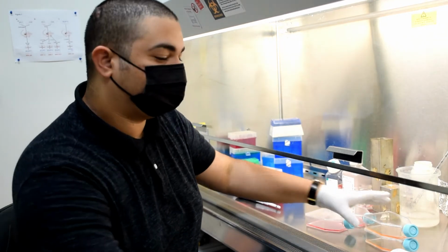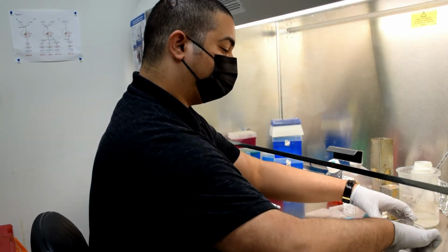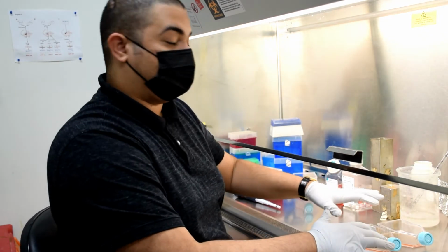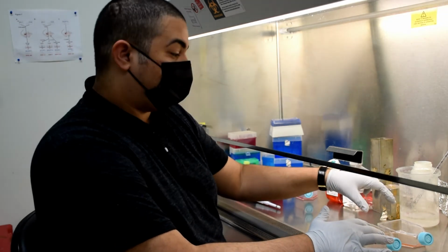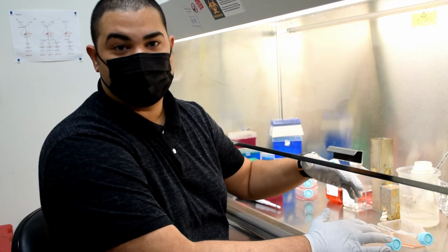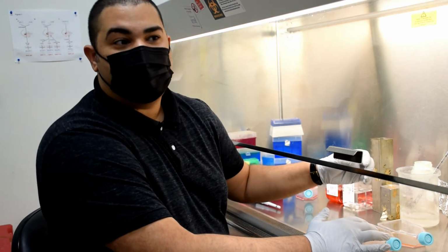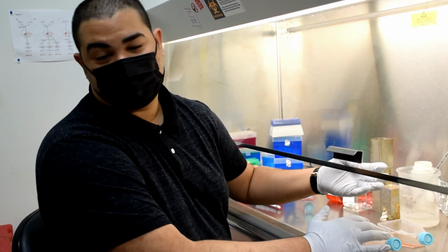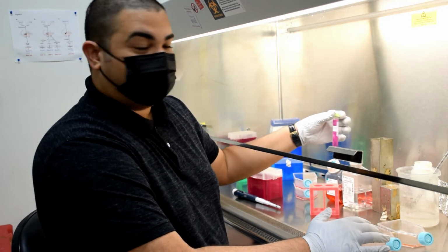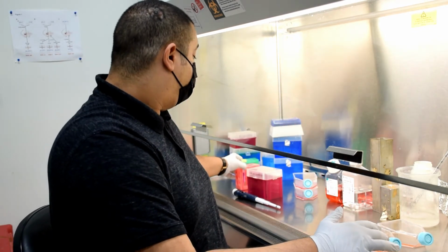So you have the cells here. Trying to keep your hands steady at all times. We're not going to use these flasks for now, but these are the cells that need to be transferred from this older flask into the new flask for me to start the experiment. So what I'm going to do is aspirate off the old media, give them a little wash, and then the cells are going to stick to the bottom of the flask, like I mentioned before. So we need to do a little treatment with trypsin to make sure to detach the cells so that I can transfer them to the new flask. So I'm just going to go ahead and do that.